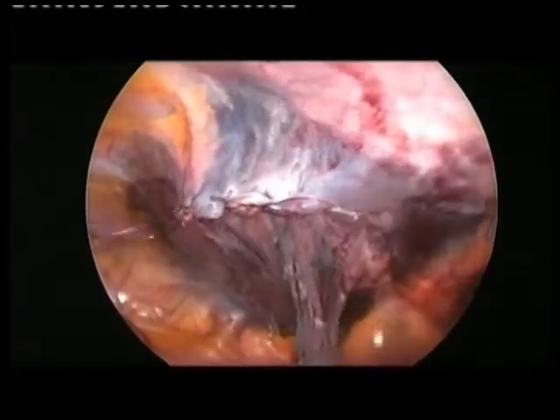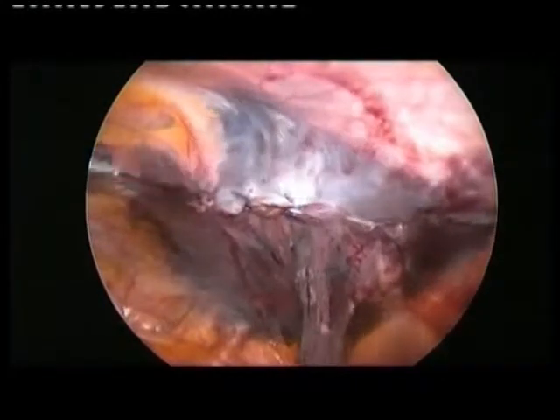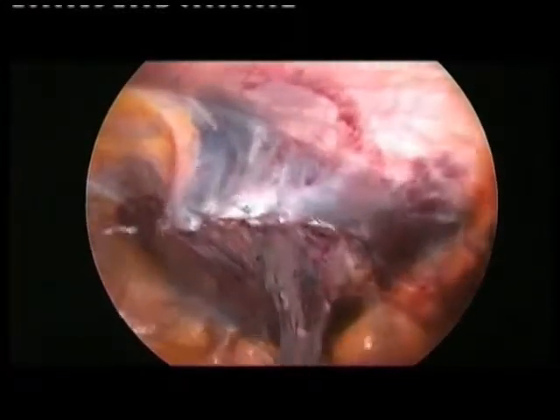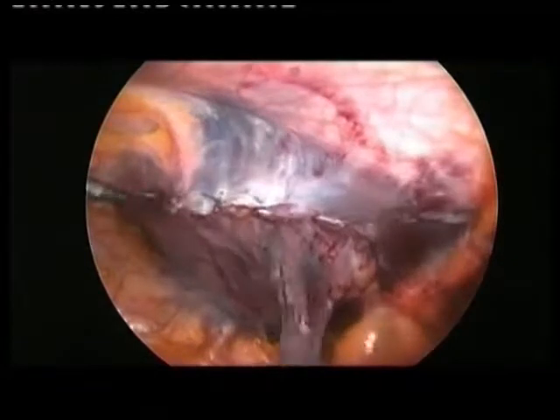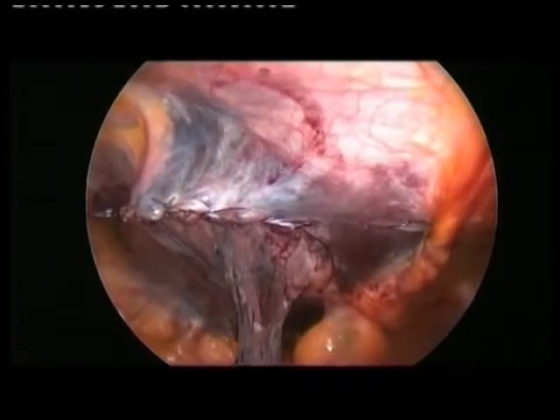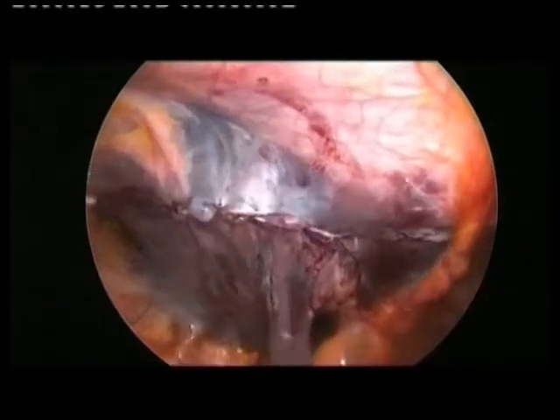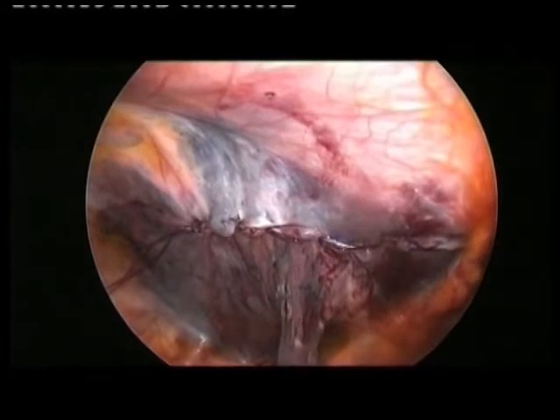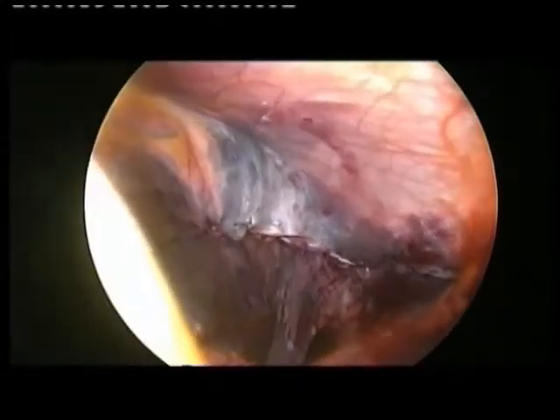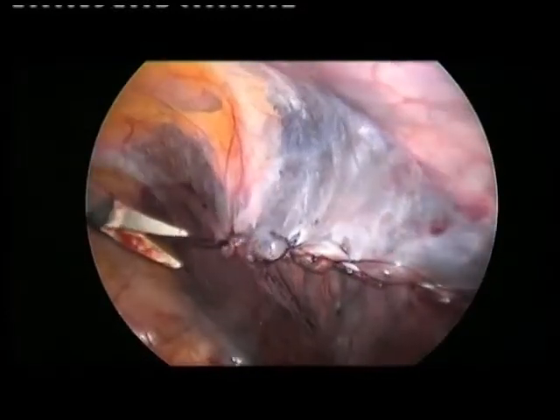I'm closing the peritoneum with these stitches. Thank you very much. It's very important in this technique to close the peritoneum very well because this avoids important complications. You see, this is a running suture with monofilament going back and forward and with extracorporeal knots. Did you use Monocryl? No, this is PDS. This is a PDS and okay.